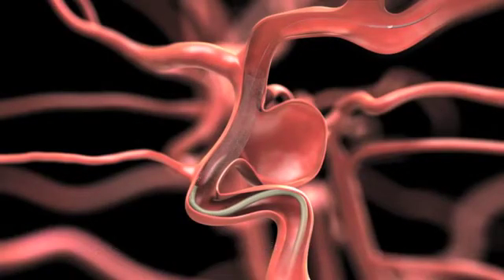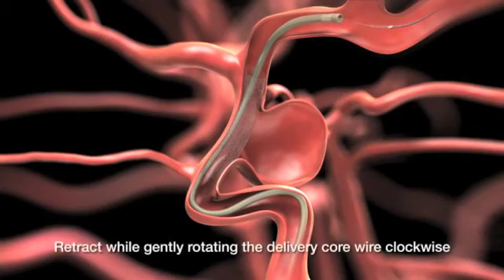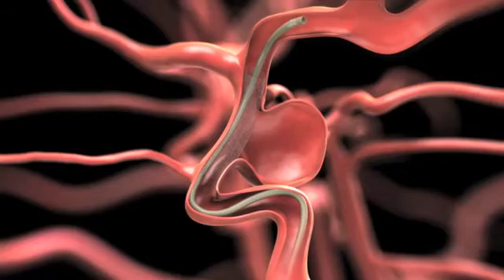The stent bridges the neck of the aneurysm completely. We then bring the microcatheter up through the stent and capture the delivery wire and remove the whole system out of the patient's body, leaving the stent across the neck of the aneurysm.